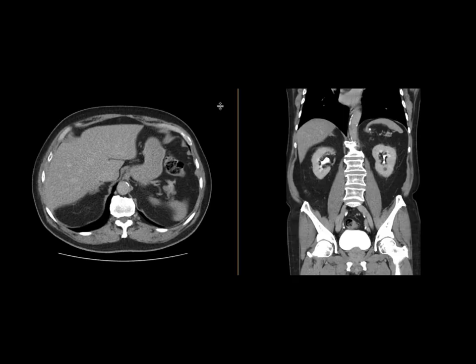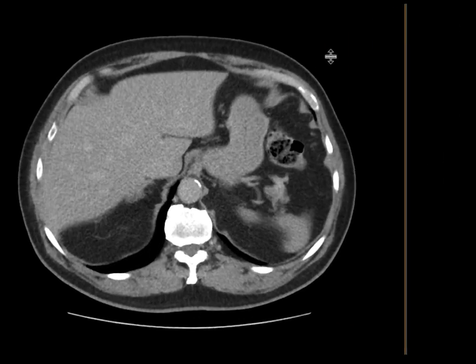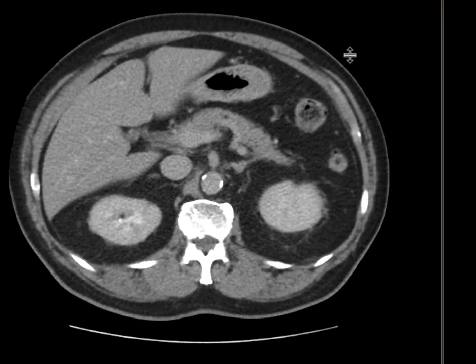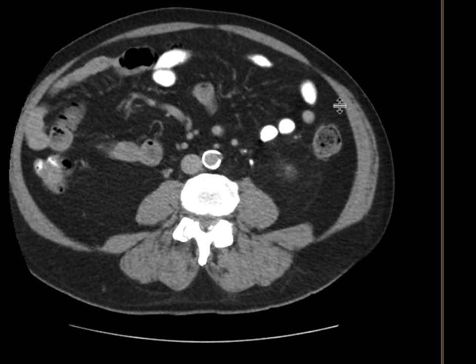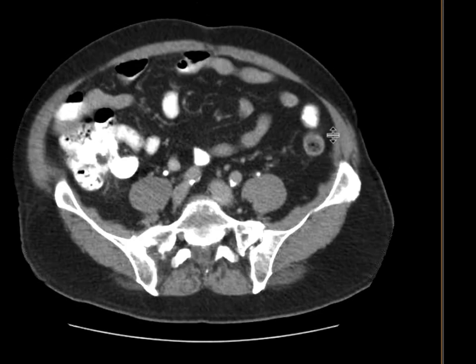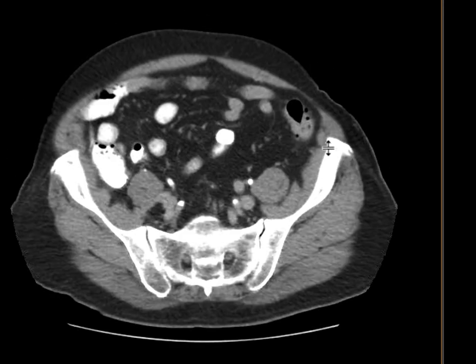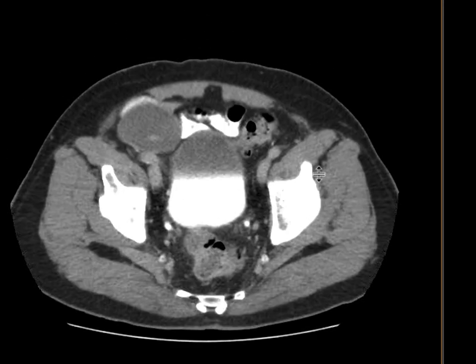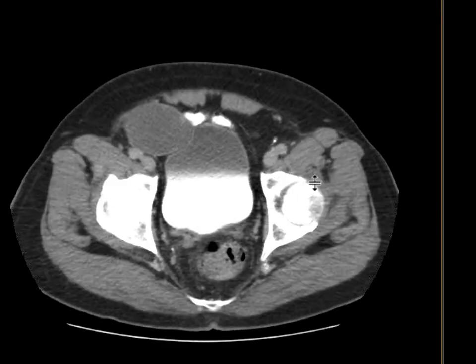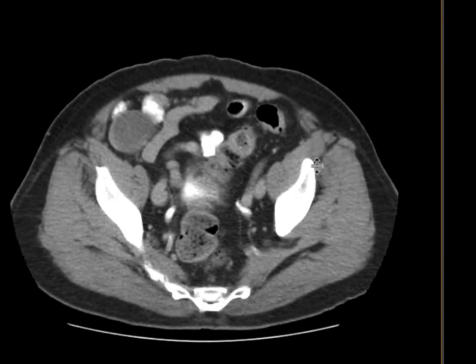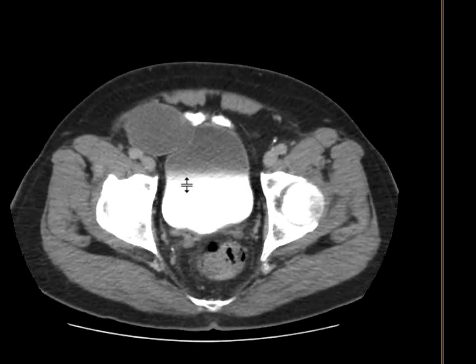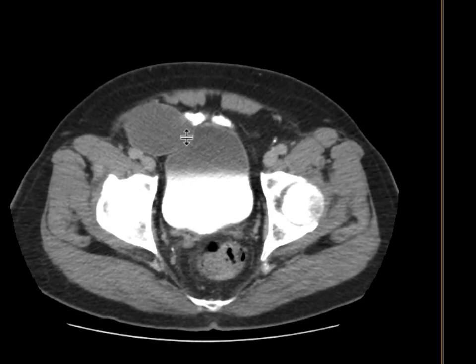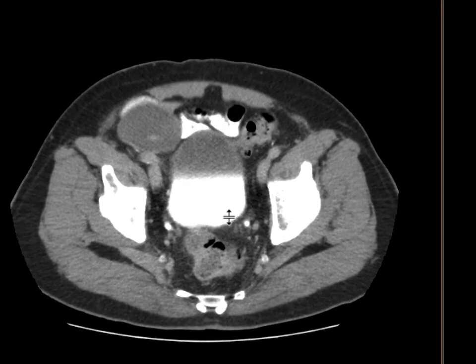This is a patient who came in with lower abdominal pain. As we look at the axial CT images with contrast — this is a more delayed excretory phase — and we scroll down to the right lower quadrant, we can start to see that there's an abnormality. It's typified by this tubular-appearing low-density mass that is extending caudally and has some mass effect upon the bladder itself.